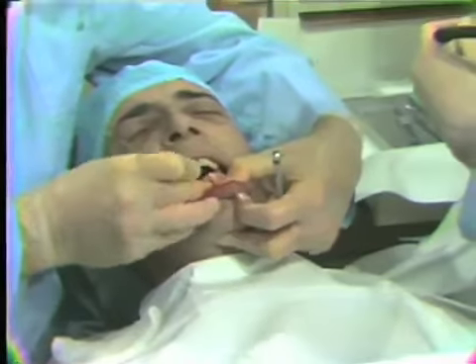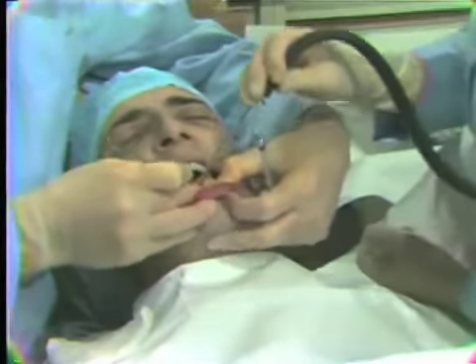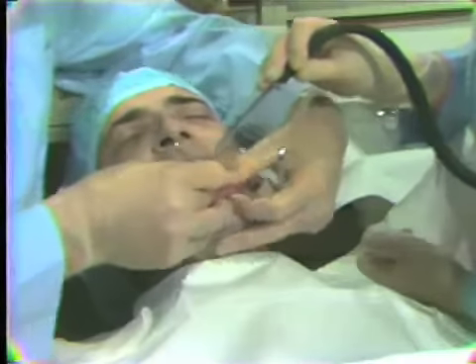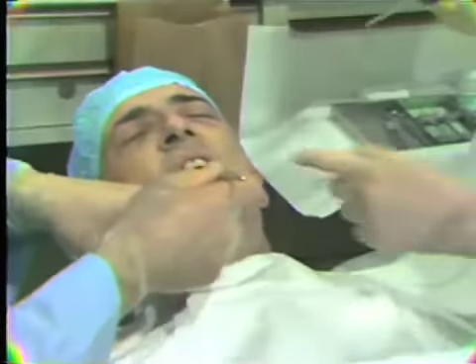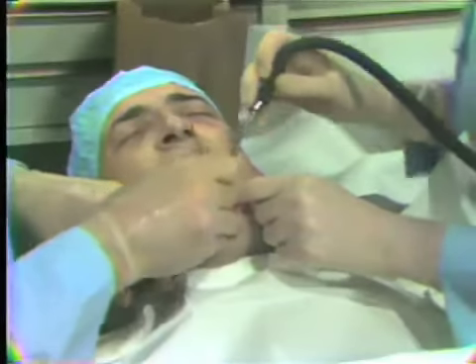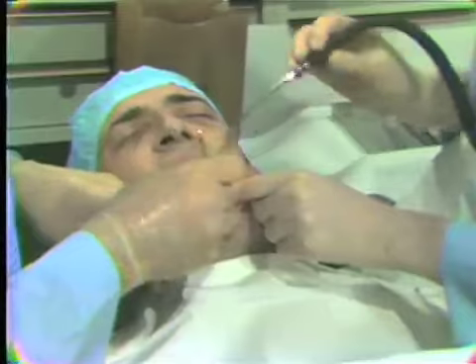There are times when it is also helpful for the assistant to retract the tissues or retract the cheek or the corner of the mouth with her finger so that we have access into areas maybe related to the surgical site. This provides me better visibility into the surgical site.